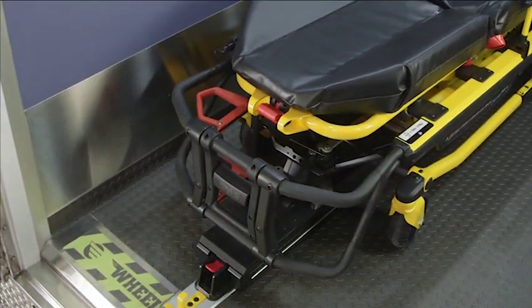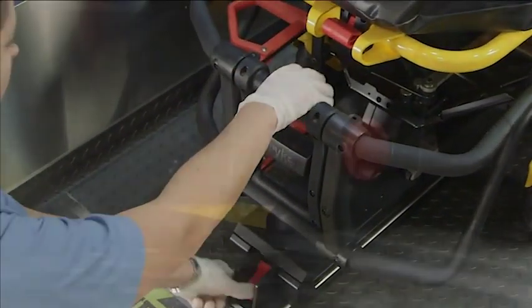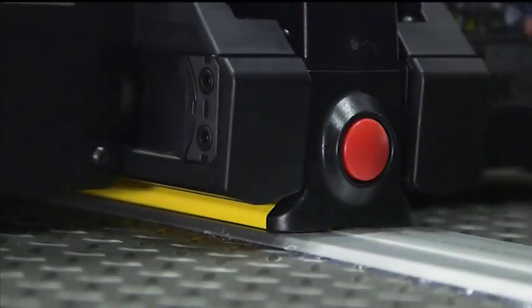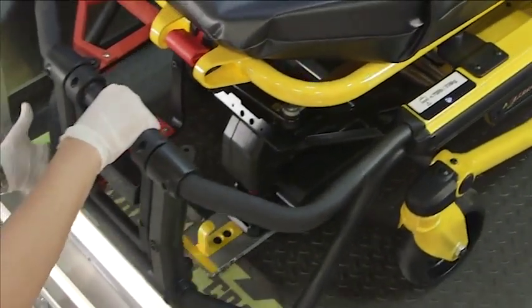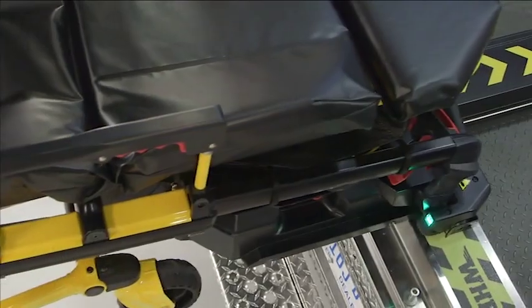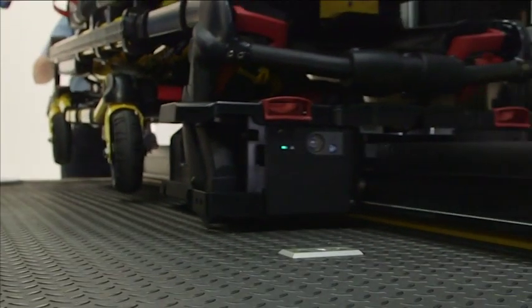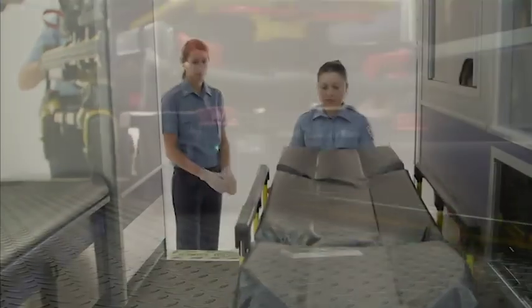To unload the manual compatible cot, first press and hold the red release lever at the foot-end of the PowerLoad system to disengage the cot from the patient compartment. Next, grab the cot frame at the foot-end and guide the cot out of the patient compartment until the head-end LED indicators turn solid green. As the cot is removed, the lifting arms will slightly raise the cot to accommodate the patient's weight and prevent the wheels from interfering with the rear sill plate.